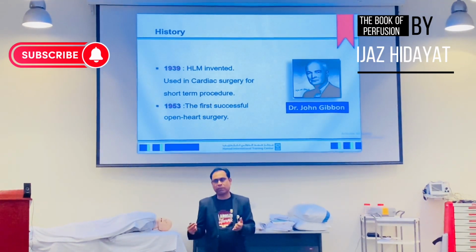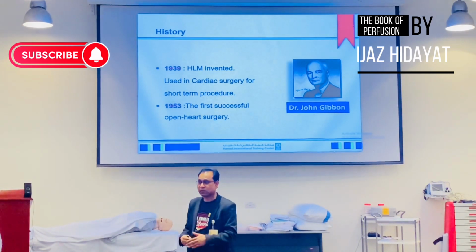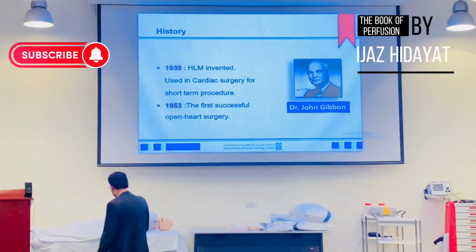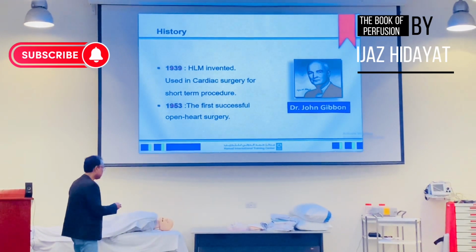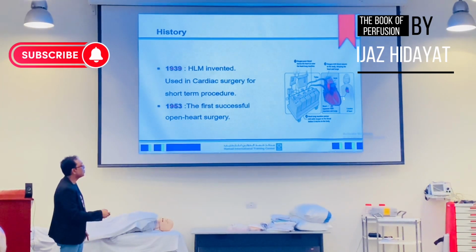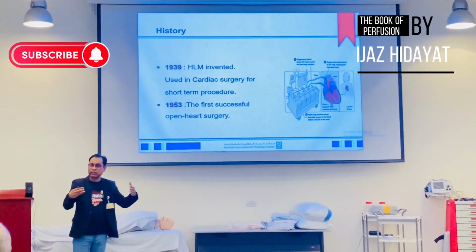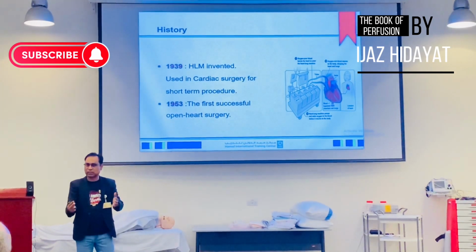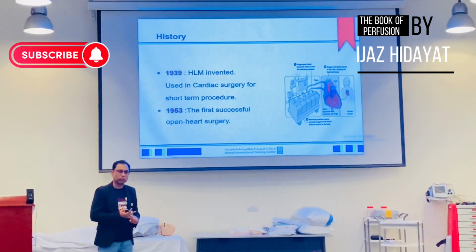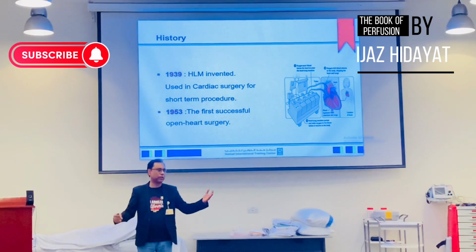And the time came when we came up with the MCS, with the ECMOs, and with the left heart bypasses, and with the mechanical heart supports and the lung supports. See how huge this machine is. And now our ECMO is very portable. It can move to any place, either in the ICU, in the operating room, or at the bedside, in the wards, and even in the playgrounds.